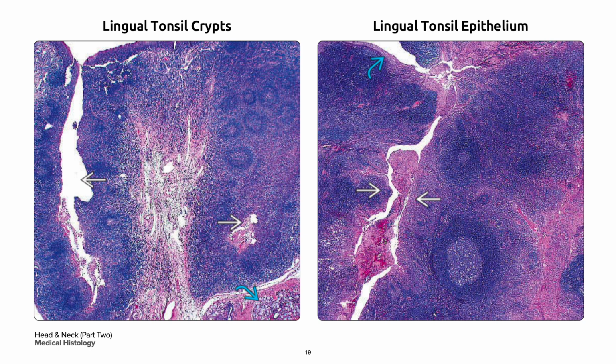represent invaginations of the surface mucosa into the lymphoid stroma. They are shorter than those seen in the palatine tonsil and often extend downward to underlying skeletal muscle and salivary glands in curved blue arrow. On your right is the surface epithelium, which is non-keratinizing stratified squamous mucosa in curved blue arrow, which becomes a specialized lymphoepithelium in the crypt zones in white single arrow.